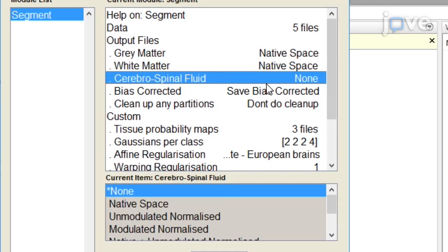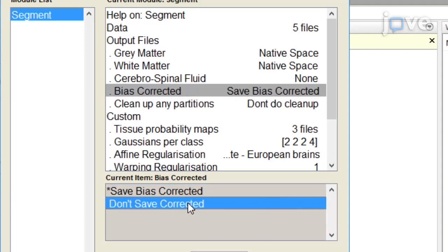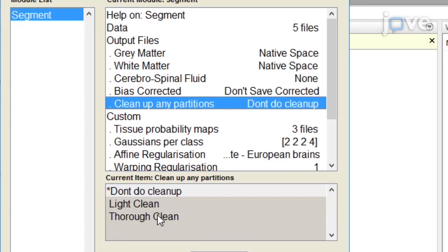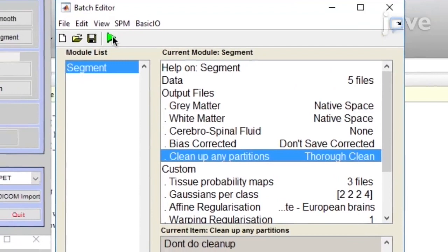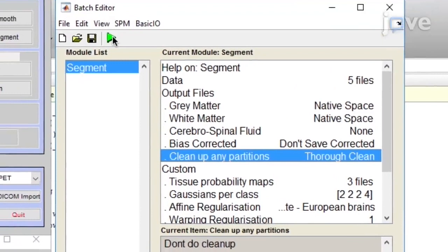If the scans have already been bias corrected, change this option to Don't Save Corrected. Then, use Clean Up Any Partitions and test all three options prior to running the full analysis. Leave the other settings set to Defaults and click on the green flag to run the segmentation.